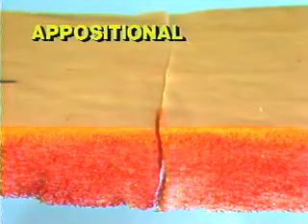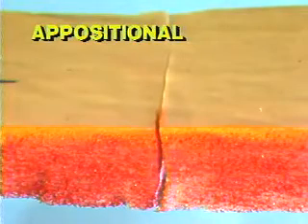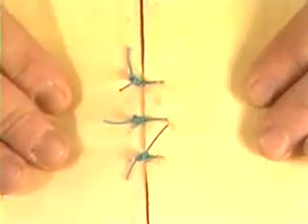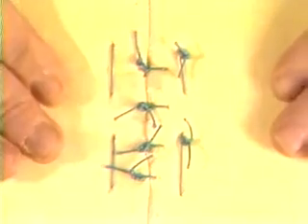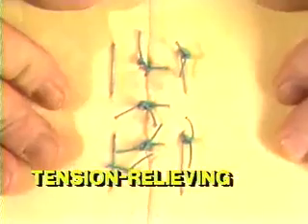Suture patterns may also be classified as: first, appositional, bringing individual tissue planes into anatomic alignment; second, inverting, turning tissue inward toward the patient or toward the lumen of a viscus; third, everting, turning tissue edges outward toward the surgeon; or fourth, tension relieving. A non-tension relieving suture gaps when pressure is placed on the tissue, while a tension relieving suture removes the tension forces from the wound.